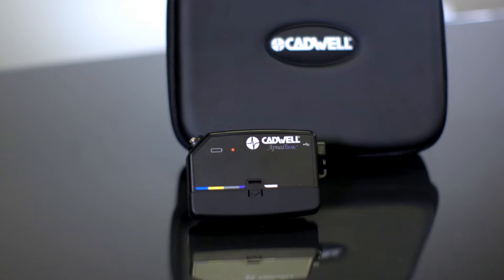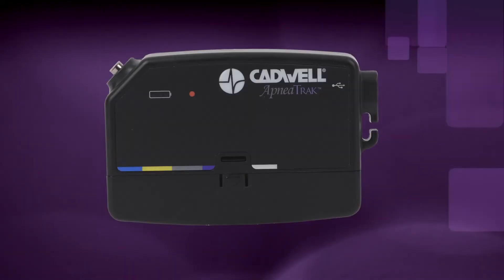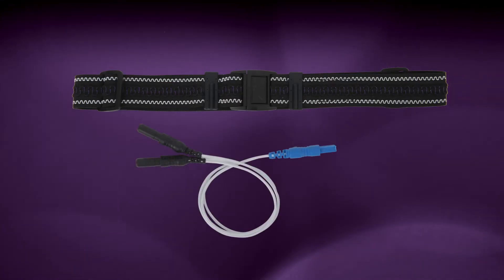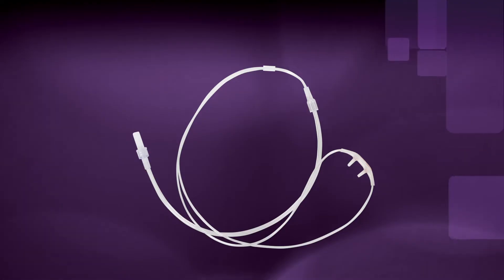If your provider gave you specific instructions, follow those instructions first. As you prepare for your home sleep test, please check the contents of your kit. Verify you have the apnea track, a chest belt cable with a blue input and two black connectors, and an airflow cannula with clear tubing.